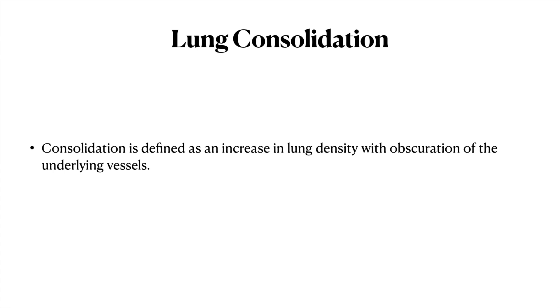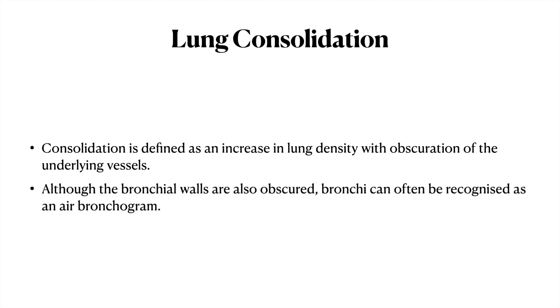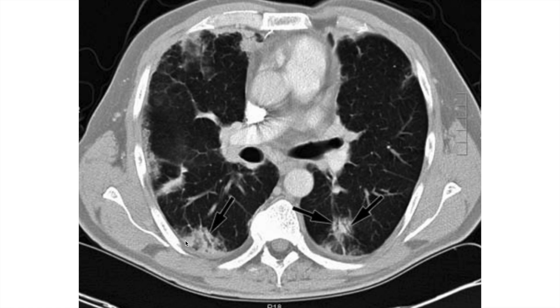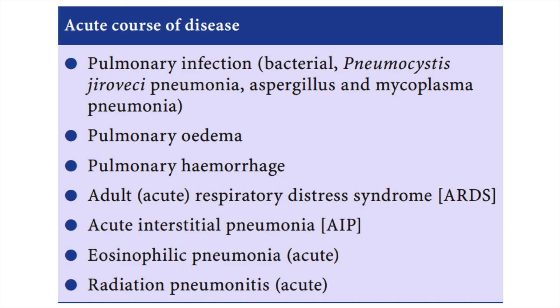The next important lung attenuation pattern is lung consolidation. It is defined as an increase in lung density with obscuring of underlying vessels. Although bronchial walls are also obscured, the bronchi can often be recognized as an air bronchogram. Here you can see patchy consolidation where there is no visibility of vessels underneath, compared to areas of ground glassing where vessels are still visible. The bronchial lumen remains visible even though the wall is obscured, giving the appearance called an air bronchogram.